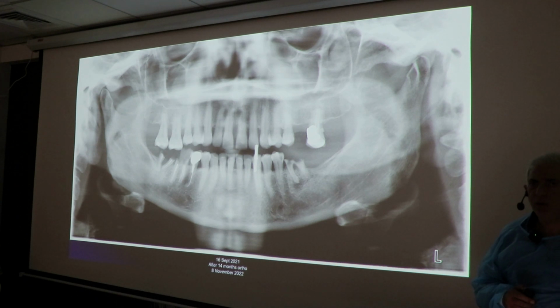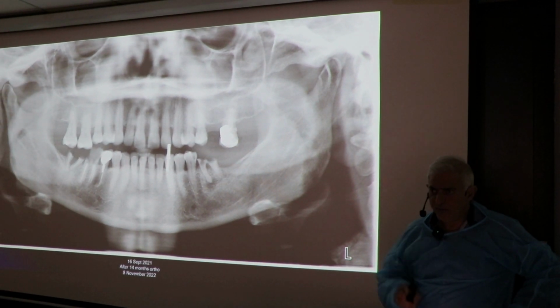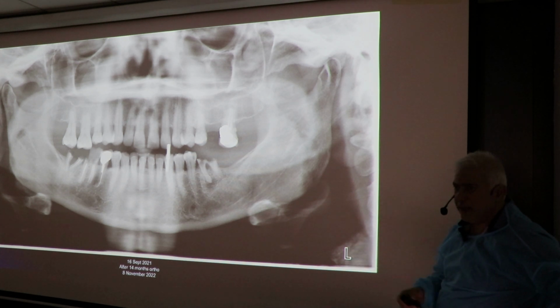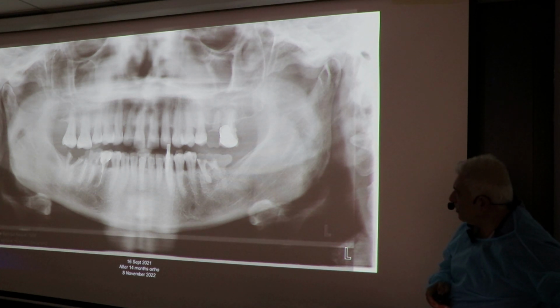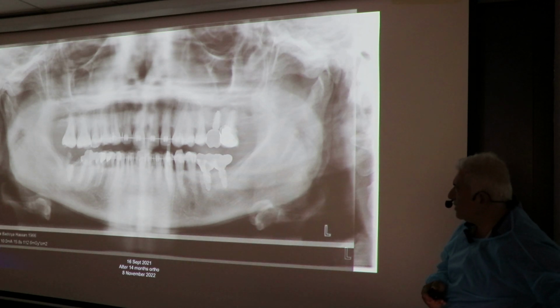Okay, since you're going to give me 5 minutes more than usual, I want to finish two cases, 2.5 minutes each, because it ends the ortho session. Now this lady, the interocclusal space was 3 millimeters. With 3 millimeters, we cannot do implant dentistry. So in her case, we did the impossible, which is intrusion. It took us a long time.